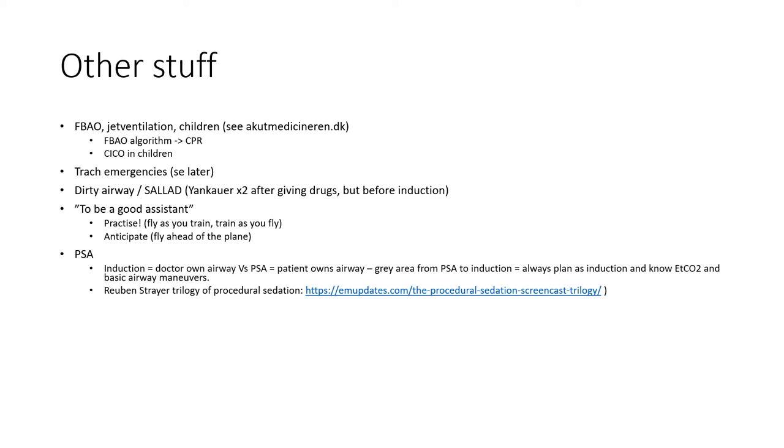And then the monitoring, the noticing of this, is among the take-home messages: it's important to have an end-tidal CO2 on the patient while you're doing it. It's also important to know your half-life and the dosing of your sedation drugs, because if you know the half-life, then you know how long you need to do these temporizing measures to get the patient in the clear.